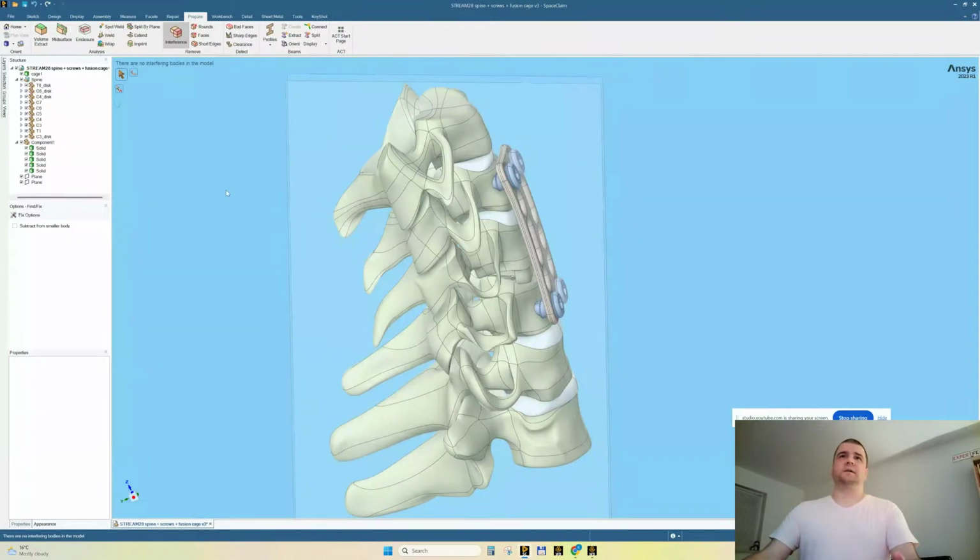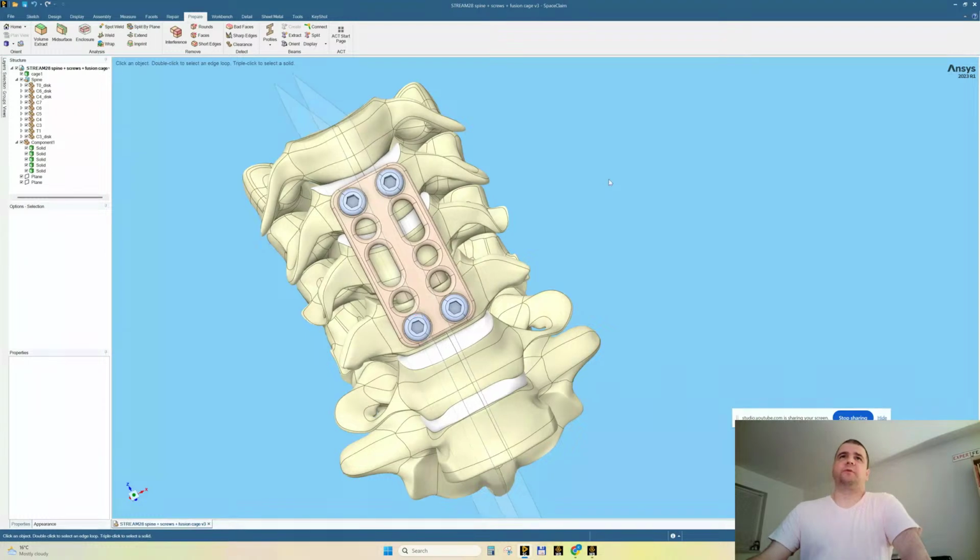So this is what we need. There are no interfering bodies in the model. Let's escape. And let's dare to save it. Now, the moment of truth. We're going to section view. We're going in multiple sections. This is the main section.